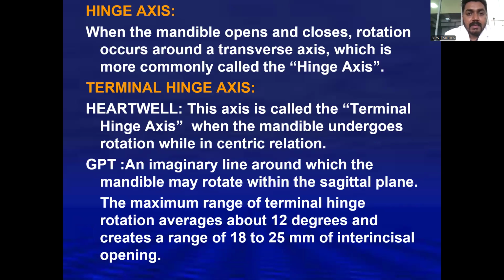Hinge axis. When the mandible opens and closes, rotation occurs around a transverse axis, which is more commonly called the hinge axis. Then what is terminal hinge axis? This hinge axis is called the terminal hinge axis when the mandible undergoes rotation while in centric relation position.